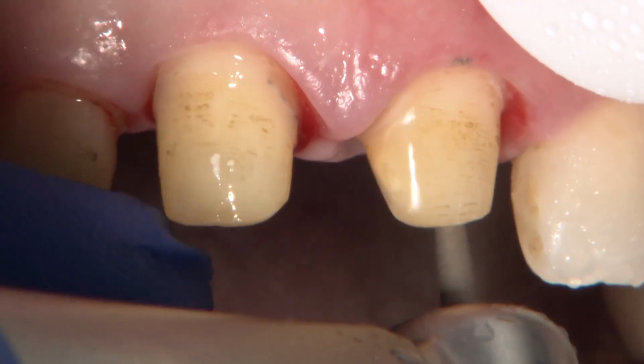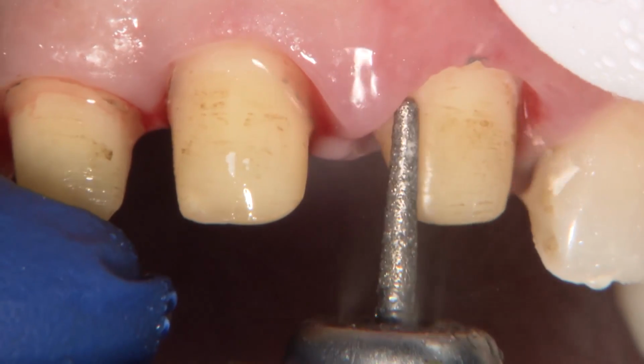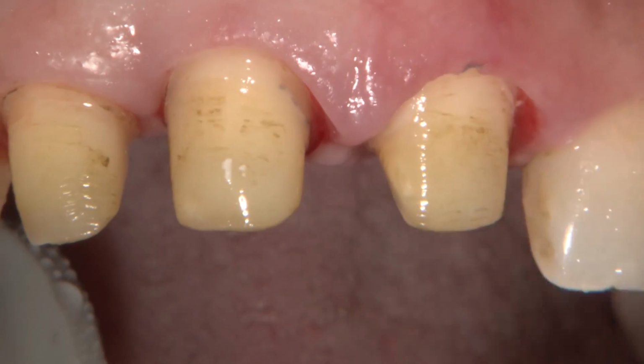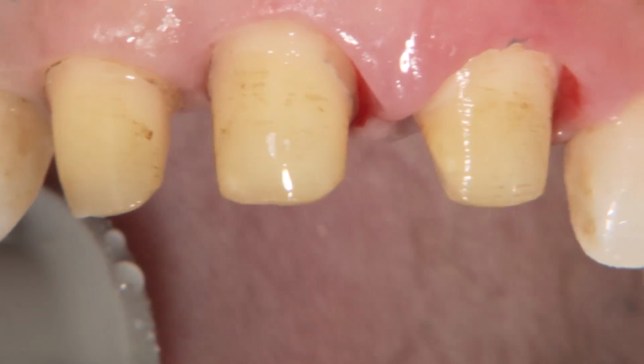restoration. Another reason for selecting a material like BruxZir Anterior is that CAD/CAM offers superior margin fit. Also, I have the ability of cementation like with any other PFM, but without the risk of a metal margin showing up if in the future the patient experiences recession again.